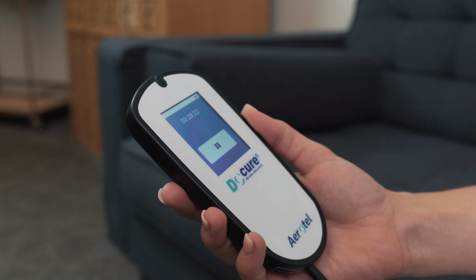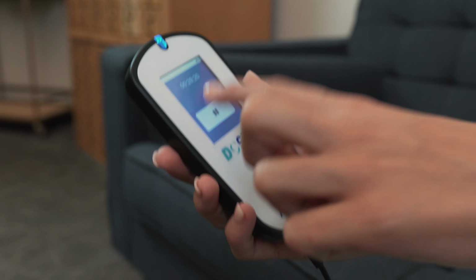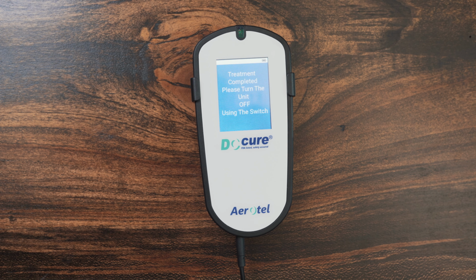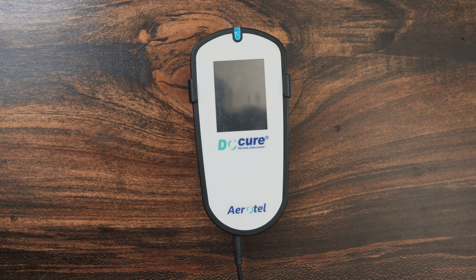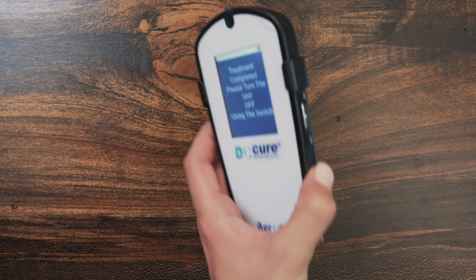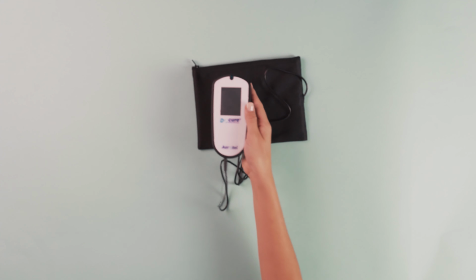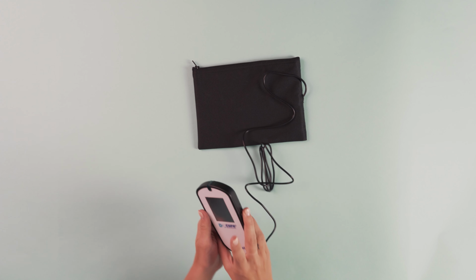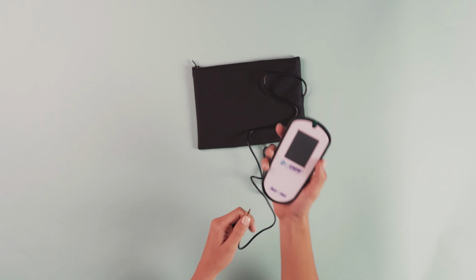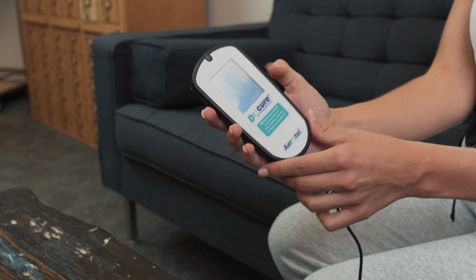You can tap the pause symbol to temporarily stop a treatment session, after which tap Start to restart where you left off. At the end of each therapy session, "Treatment completed, please turn the unit off using the switch" will appear and the flashing LED will change from blue to amber. After which, you slide the power switch from the on to off position. If you forget to slide the power switch from on to off at the end of a treatment session, you'll need to slide the switch from on to off and then to on again to start your next session.